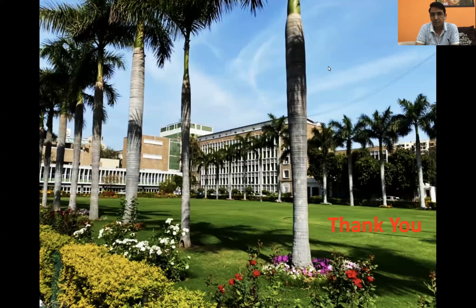Now, coming to the specific six questions that came up during the chat box discussions. Number one was septal length. One of the persons, I could not identify his name because the phone's name was coming up, was talking about the septal length being a controversial situation. In fact, Saurabh clearly told that the principle of assessing the septal length is to ensure that the left atrial disc does not far exceed the septal length. I think this goes by simple logic and principle. It really holds good. I think it is a good idea to follow that.